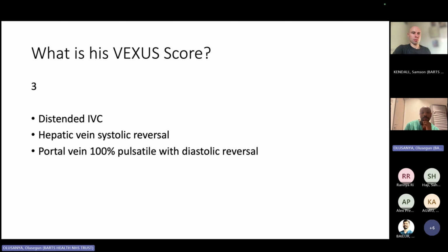And the last big one is, of course, abdominal compartment syndrome, because that basically throws off everything and squishes your IVC, so therefore you can't use it. It doesn't work in ECMO as well, because you've got a big pipe in the IVC draining stuff, so that doesn't work.